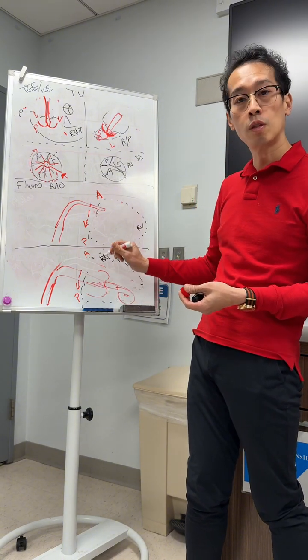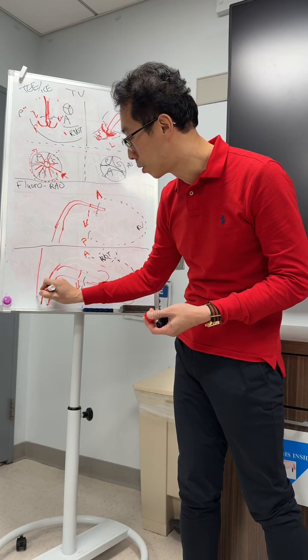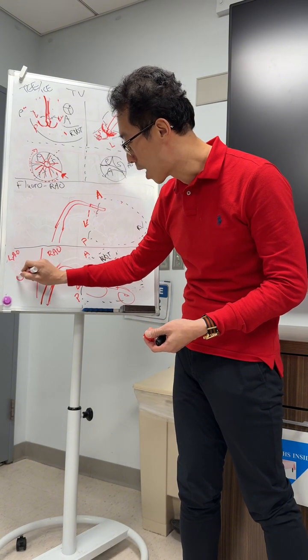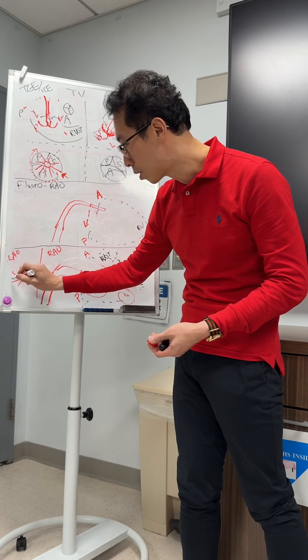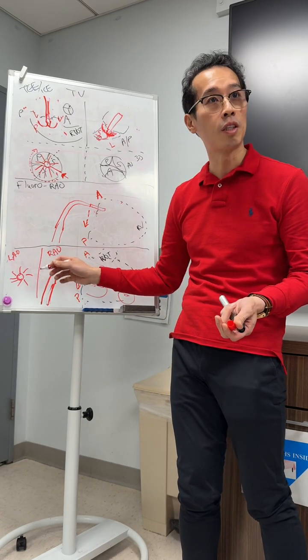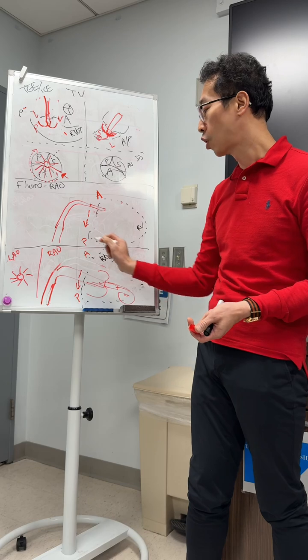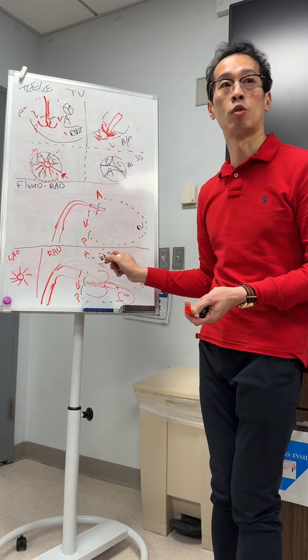You should be able to look at an LAO projection. Let me just draw it here, a little space here. This is LAO. Remember this LAO. You will see here the capsule. And then you'll be able to see where the lead is, or if there was a TEER device there before, you know roughly where you are in terms of orientation. You can kind of match it here to confirm. So we often rotate back and forth to get your fluoroscopic view as well.